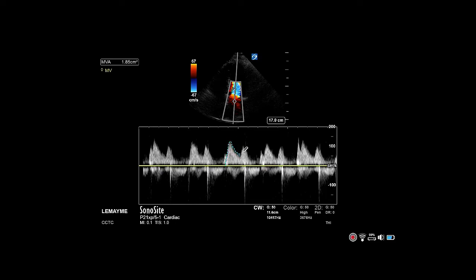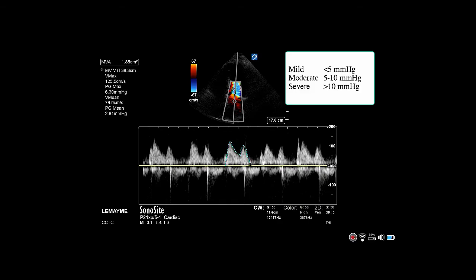The machine will then use the tracing to calculate the mean velocity, which in turn can calculate the pressure gradient across the valve. The gradient is used to determine if the stenosis is mild, moderate, or severe.